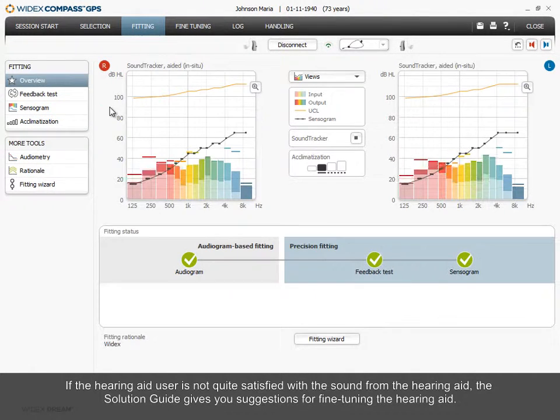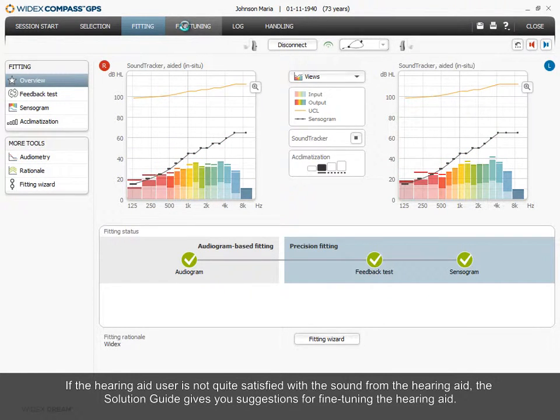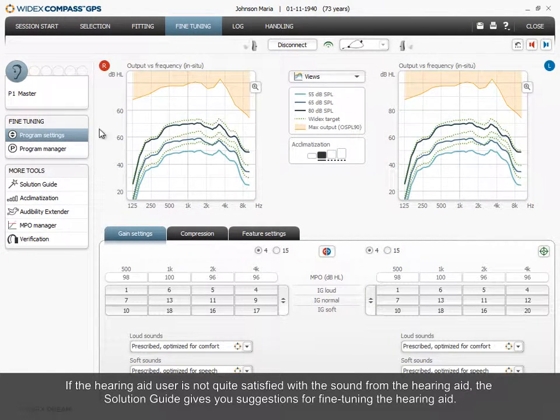If the hearing aid user is not quite satisfied with the sound from the hearing aid, the solution guide gives you suggestions for fine-tuning the hearing aid.